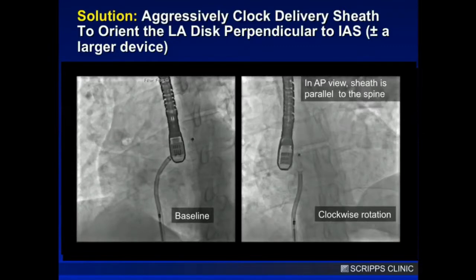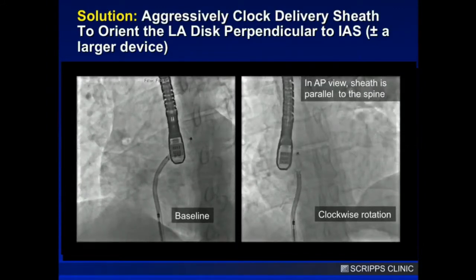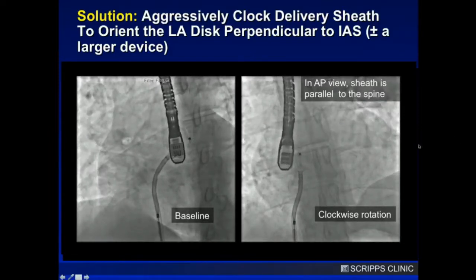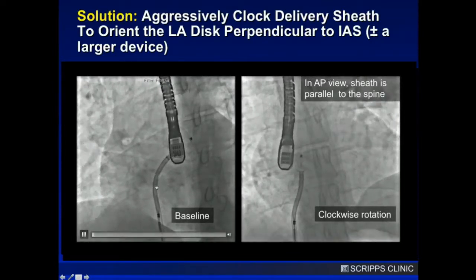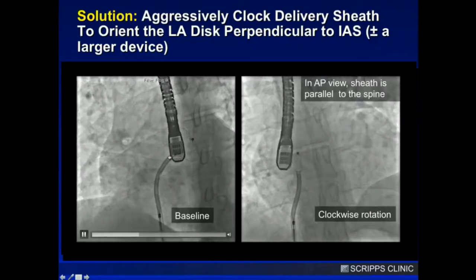The basic fundamental concept to overcome this, which works 9 out of 10 times, is to aggressively clock the delivery sheath so that it brings the left atrial disc orthogonal to the septum. A good rule of thumb on fluoroscopy is when the sheath is parallel to the spine in the straight AP projection. You can see the normal conformation of the delivery sheath — just a standard torque view, 45-degree sheath.